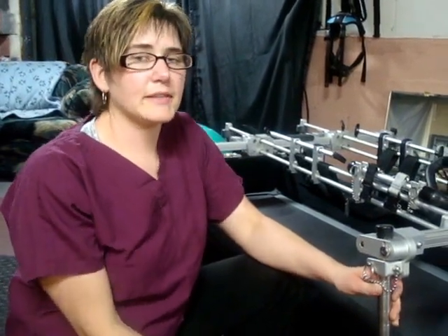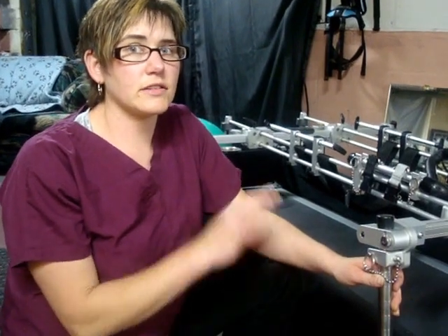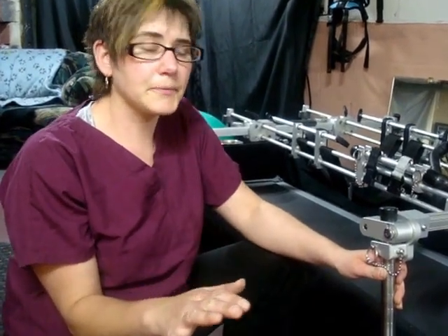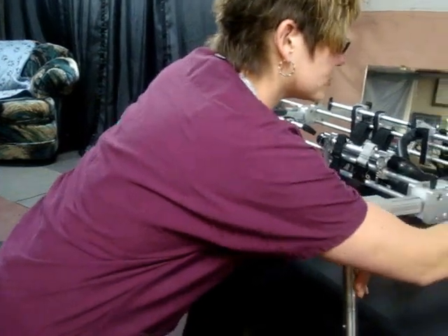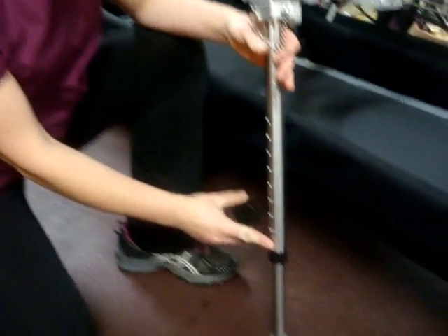We're going to demonstrate a basic leg adjustment for the height, and you're going to need to do this on all four of your legs so that the stand stays even front to rear. You want to make sure you use the tool that's provided, and this is going to be used to push the push pins.